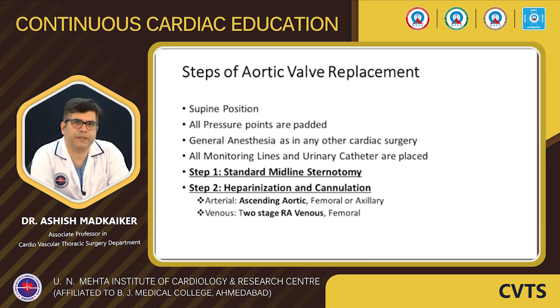Coming to the steps of aortic valve replacement, as in any other cardiac surgery, we will do this procedure under general anesthesia, and we'll introduce all the monitoring lines, catheters, and the necessary precautions to be taken for any cardiac surgery. Usually the surgery is conducted in supine position. We should make sure that all pressure points are well padded to prevent any pressure injuries. Step 1 is to do a standard midline sternotomy.